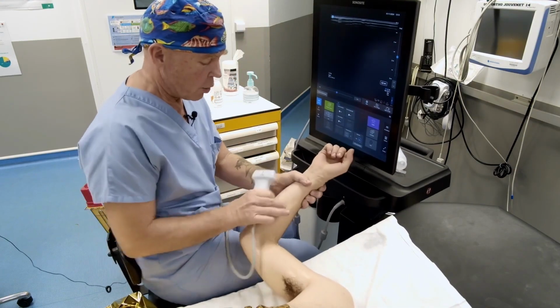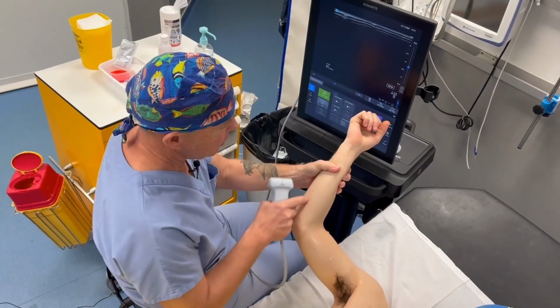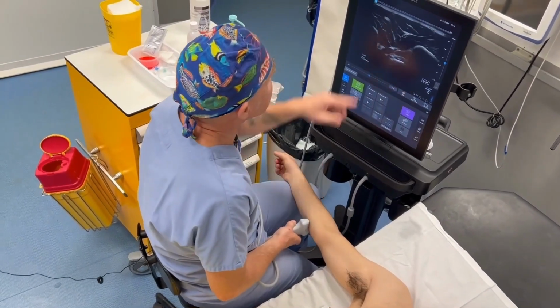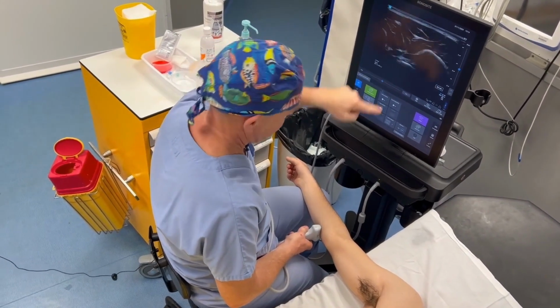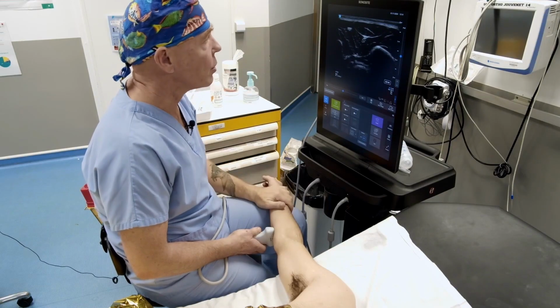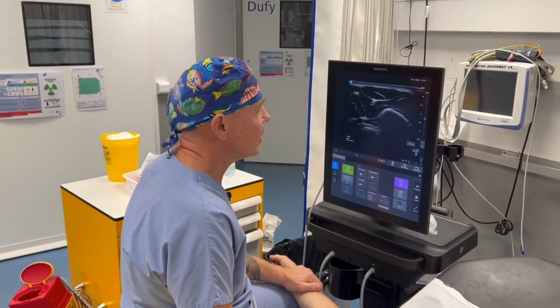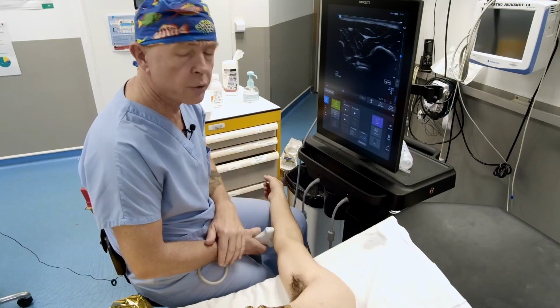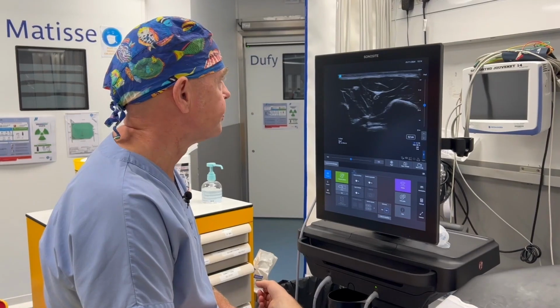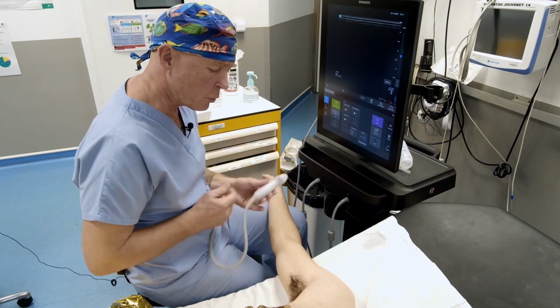So I told you about this big muscle here, the FCU. You position yourself at a good spot, 9 to 10 centimeters here. Then you place your probe like this, and as you can see, we find exactly the same image as earlier. You just need to enhance it with the ulnar nerve, which is at the top. This is quite common, it's almost always the case. With this image, there are very few anatomical variations at this level, and it allows you to achieve a 100% success rate with your blocks. So here we clearly see the elements we looked at right at the beginning.